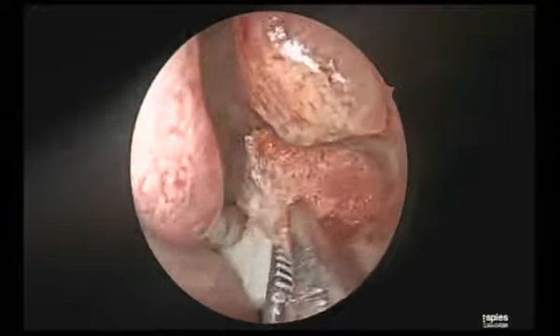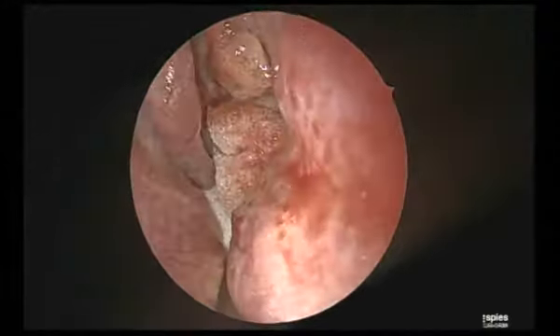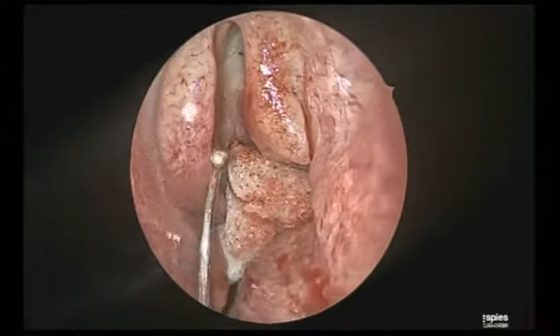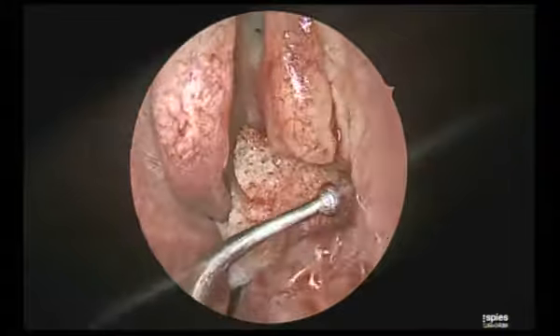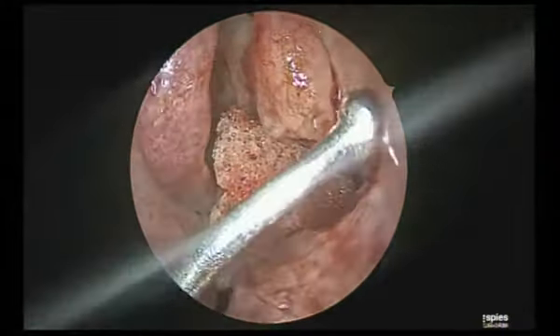So Satish, in this step, is there anything that you can harm? Anteriorly, you said the nasolacrimal, yes, very important. Posteriorly, is there something here? Yes, Ashish. The only important thing in this step, why we opted for this one: if you use the uncinate, you have a fear of entering the orbit. Sometimes the uncinate is closed. So in this step, the only important thing is to take care of the nasolacrimal system.